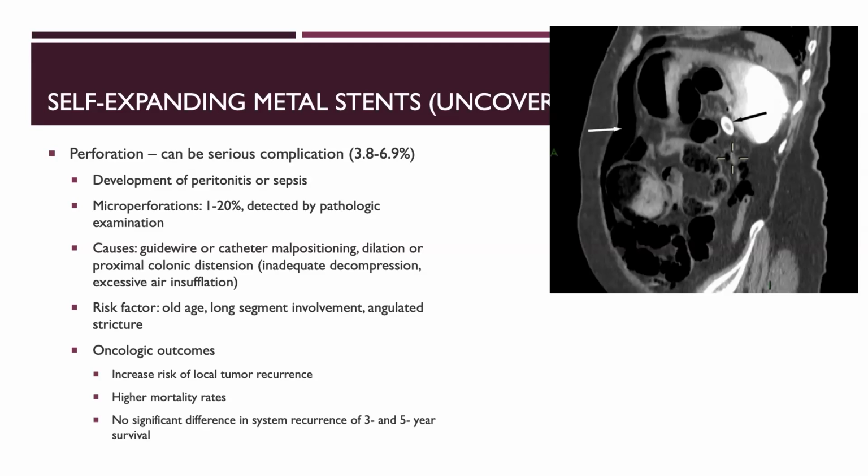In terms of oncologic outcomes, there's increased risk of local tumor recurrence. There was a small study that looked at doing colonic stenting in young patients with locally not advanced colon cancer, and there was a risk of micrometastasis with putting a stent in.